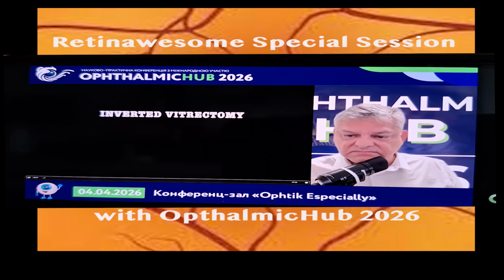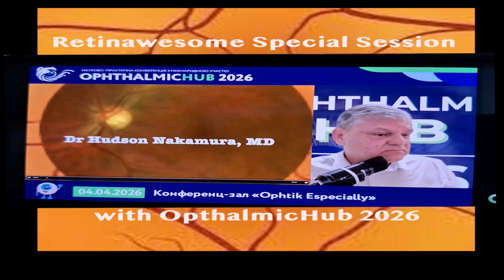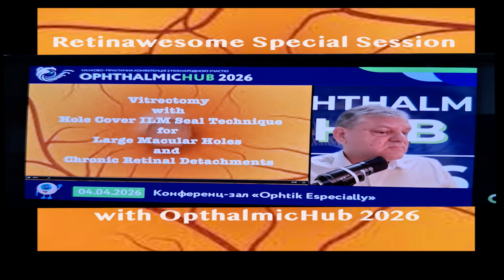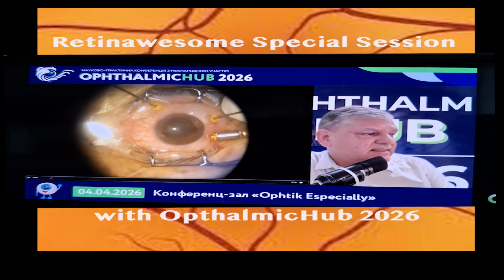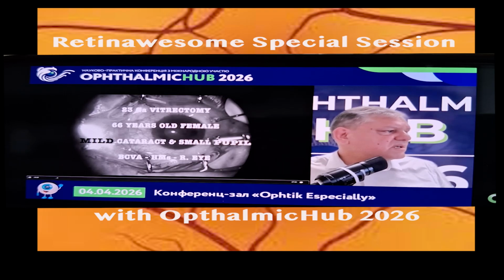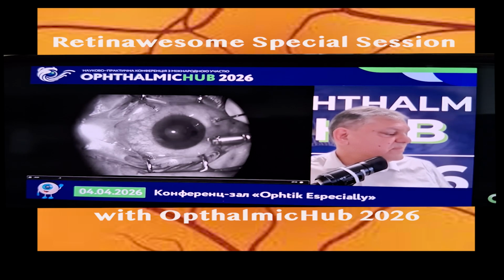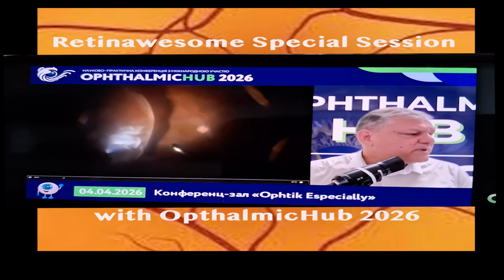So I start the case and I move it forward a bit. So we are at the Eye Bank Foundation, vitrectomy with a hole cover technique or ILM seal technique. This was a 66 year old female, a phakic one, had some cataract and a small pupil. This was the right eye, and as you see, we start the vitrectomy here.